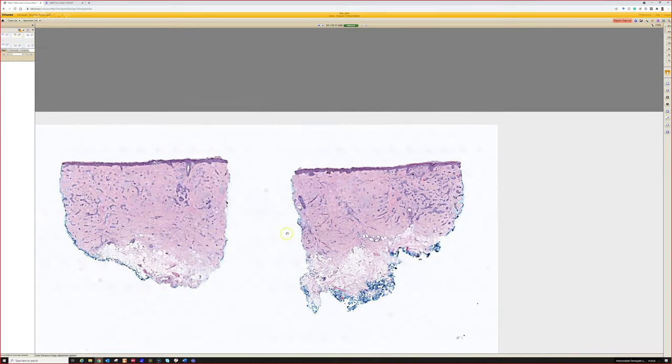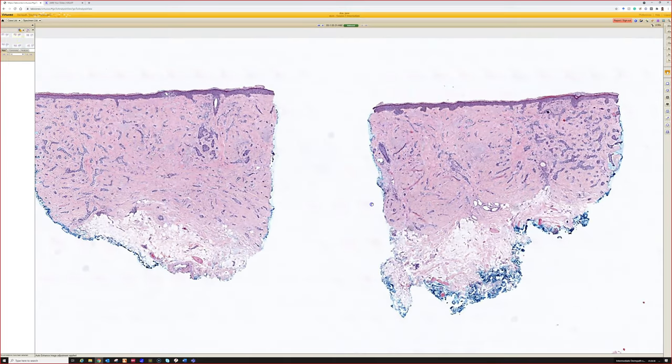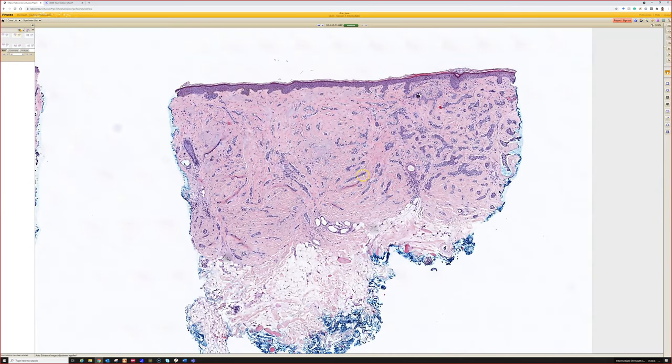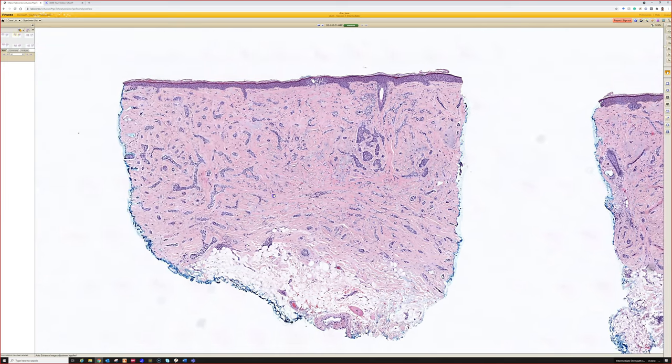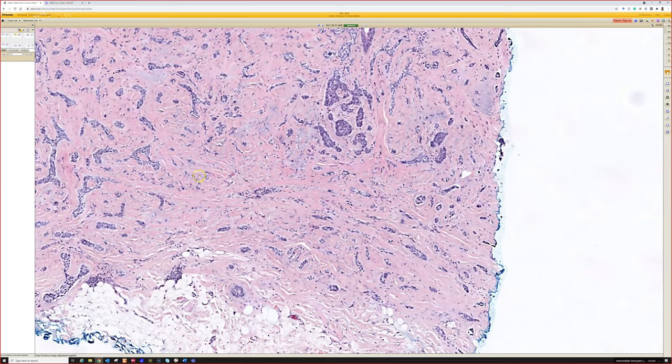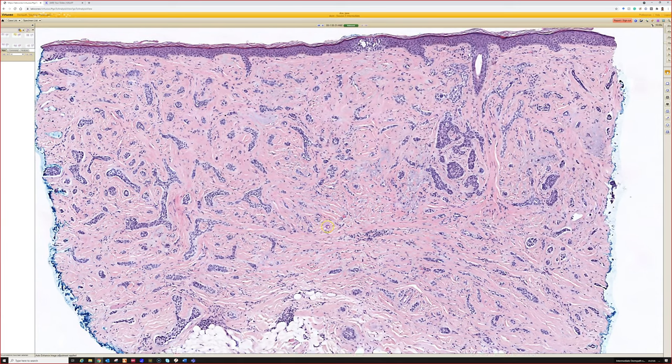And then the final case, 31. Great example. Yeah, so as you guys know, I lump all the aggressive subtypes of basal cell carcinoma and usually just call them infiltrative type, which covers morpheiform, micronodular, and other ones that have overlap between those. But this is the one to burn in your mind as a classic example of what true morpheiform looks like.